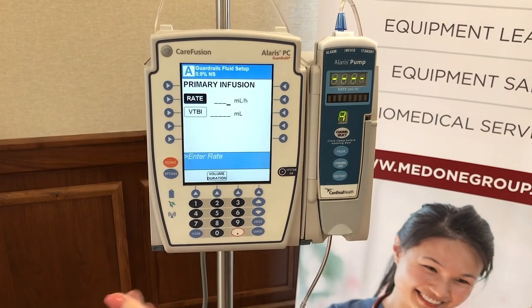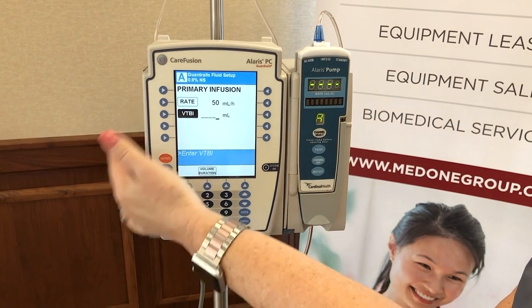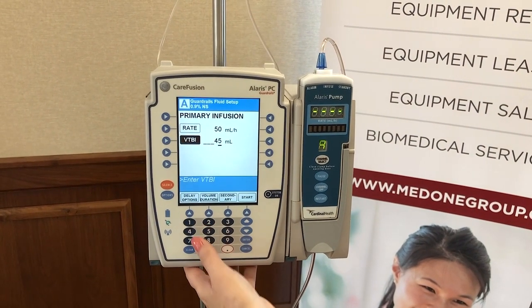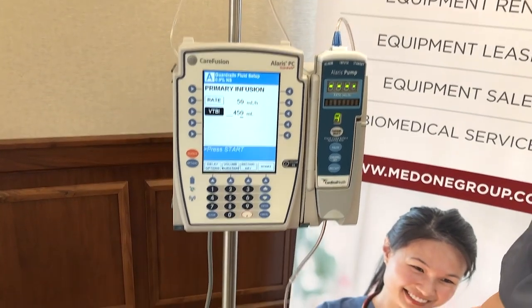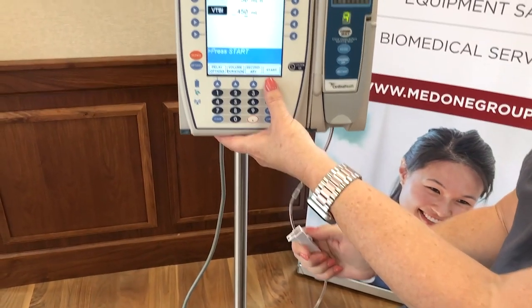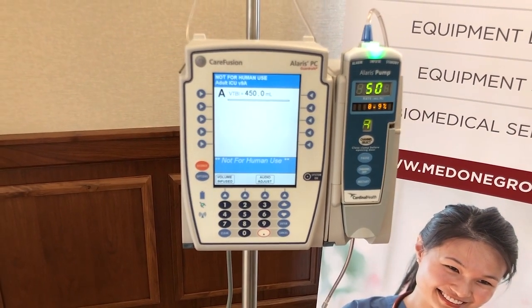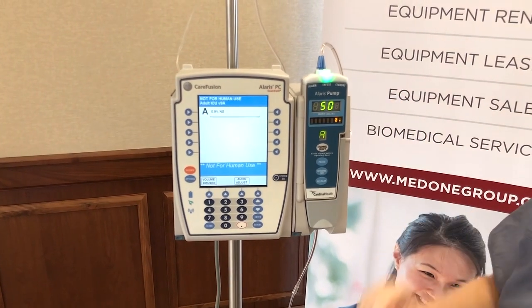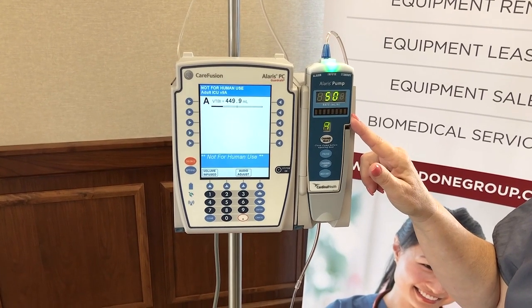We're going to set a rate of 50 and a volume of about 450 — we have a bag size of about 500, so we're underestimating slightly. We'll open our roller clamp and then press start. On the pump module, green is good — that means it's infusing. The rate is listed as 50, and you have your 0.9% normal saline scrolling across the marquee.